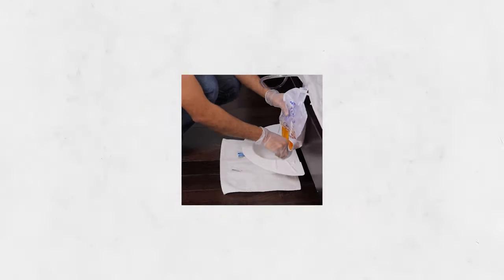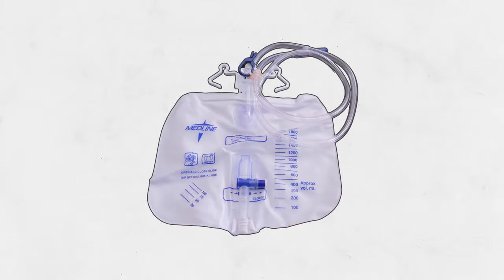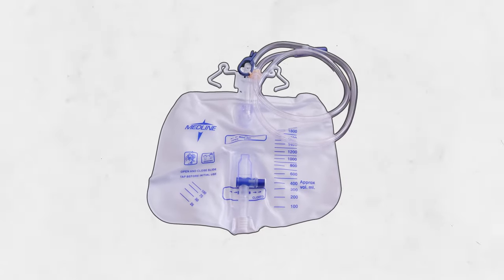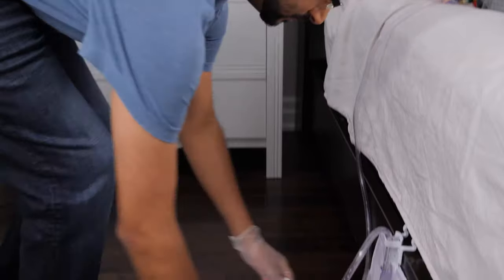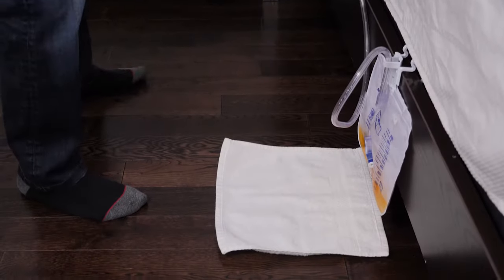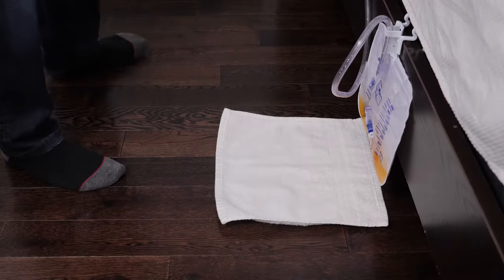Empty the bag. Let's start by learning how to empty a catheter bag, a plastic bag that attaches to the catheter tube to catch and hold urine. To do this, you'll need a container to empty the bag into, an alcohol swab, and some gloves. It's not a bad idea to have a waterproof pad or towel to put under the container in case of splashes.